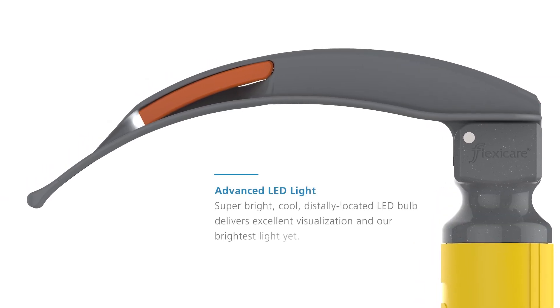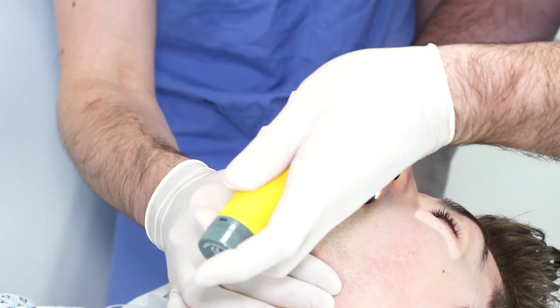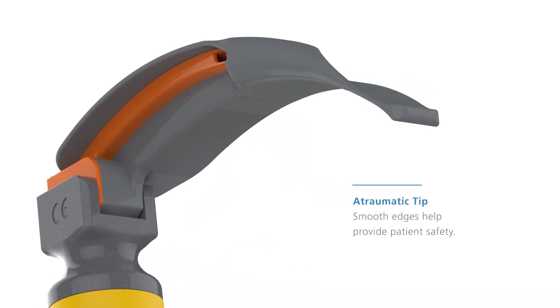The super bright, cool, distally located LED bulb delivers excellent visualization and our brightest light yet. Each metal blade has a smooth non-reflective coating to reduce back glare. The atraumatic tip and smooth rounded edges help provide patient safety.